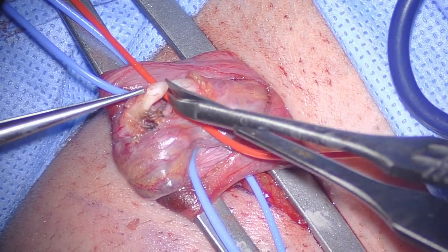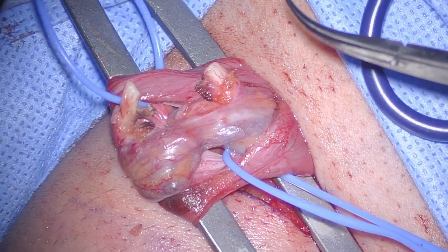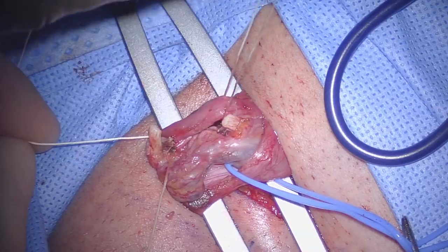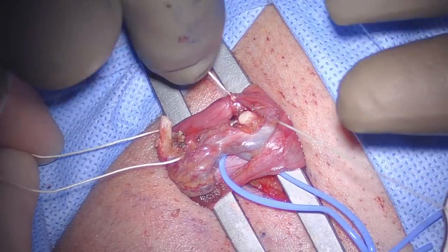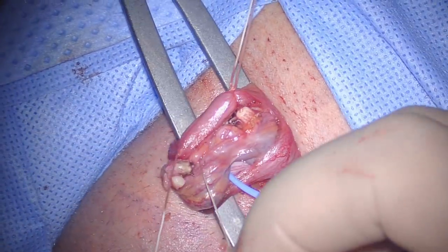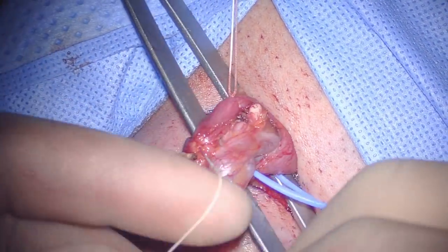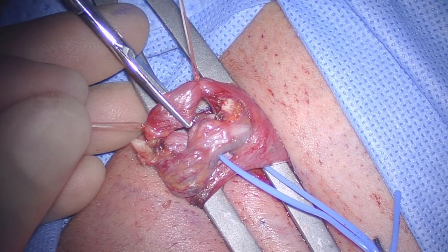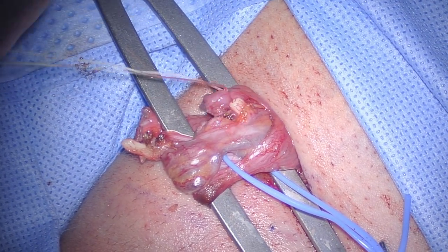It is then divided sharply. Confirmation of testicular artery preservation is performed. 3-0 Vicryl ties are used on the cremasteric fibers, and the cremasteric fibers are divided. Fibers are also divided in a similar fashion on the contralateral side. The proximal ties are left long for easier control of the cord structures.